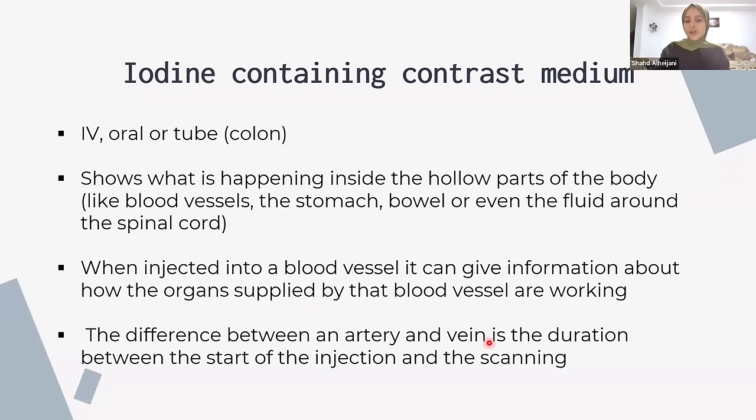So the difference between an artery and the vein is the duration between the start of injection and the scanning. Remember, we said when we put a contrast, you also have to keep in mind the timing. If you inject the contrast and then scan immediately, the things that will light up are basically the arteries. But later on, when you wait, the contrast will move to specific areas, so other areas will light up. So yes, the contrast will show you what's happening in the vessels, but it depends on the timing and the duration between the injection and when you scan.